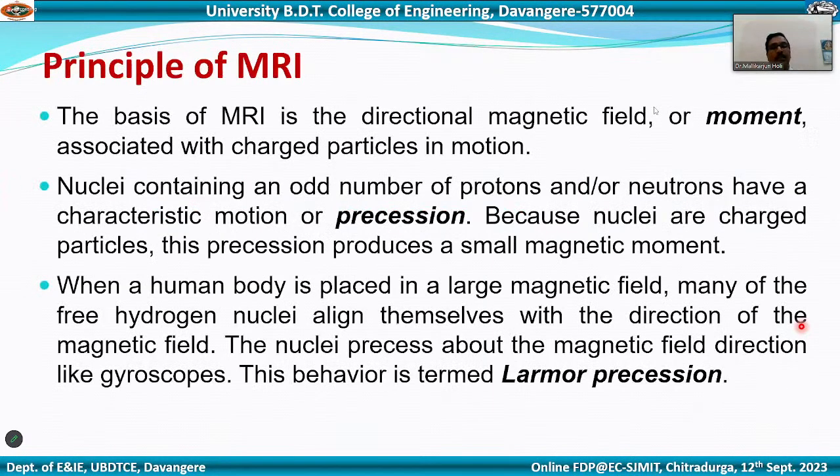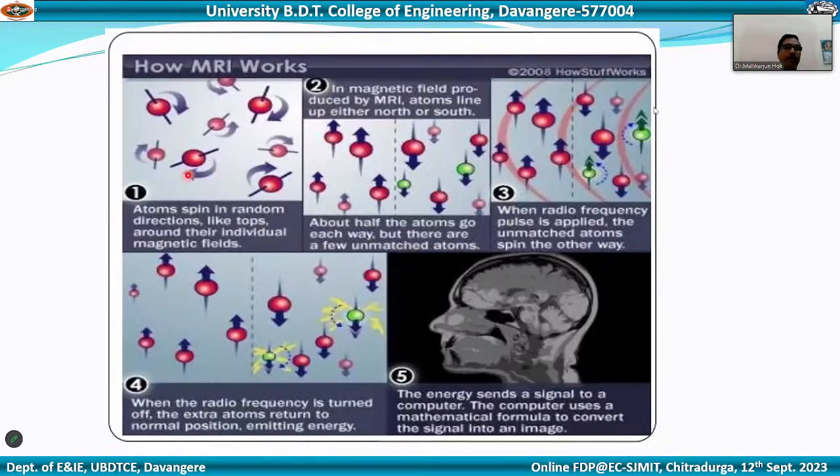So, magnetic resonance imaging. You use the magnetic principle here. We have water in the body, and in that we have a nucleus. In that we have the protons, the positively charged bodies. Under normal conditions, all these particles are randomly aligned. So the net magnetization here is going to be 0.